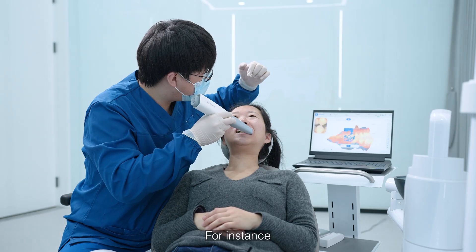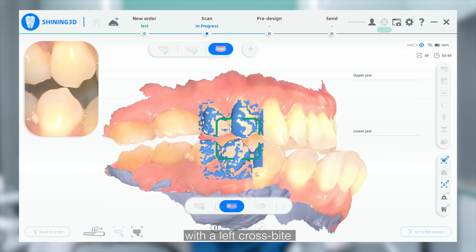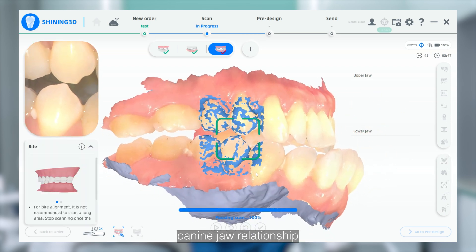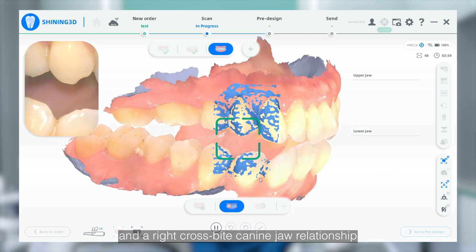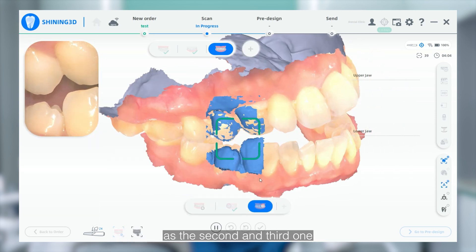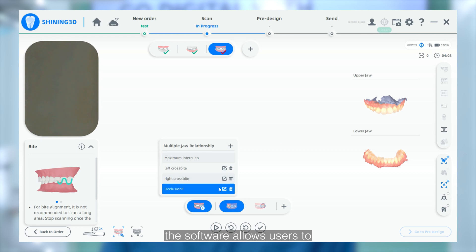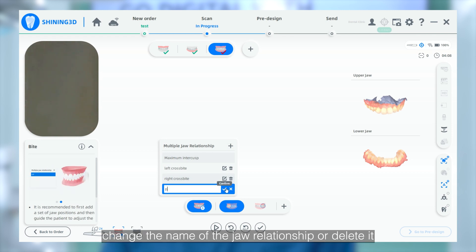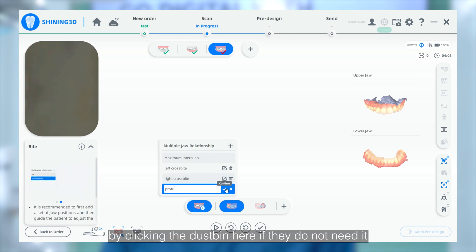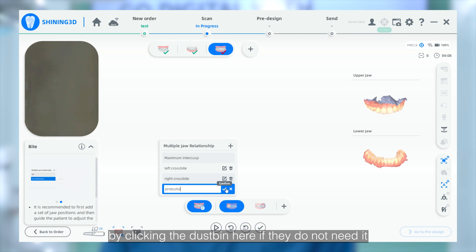For instance, we can scan occlusion information with a left crossbite jaw relationship and a right crossbite jaw relationship as the second and the third one. The software allows users to change the name of the jaw relationship or delete it by clicking the delete button here if they do not need it.